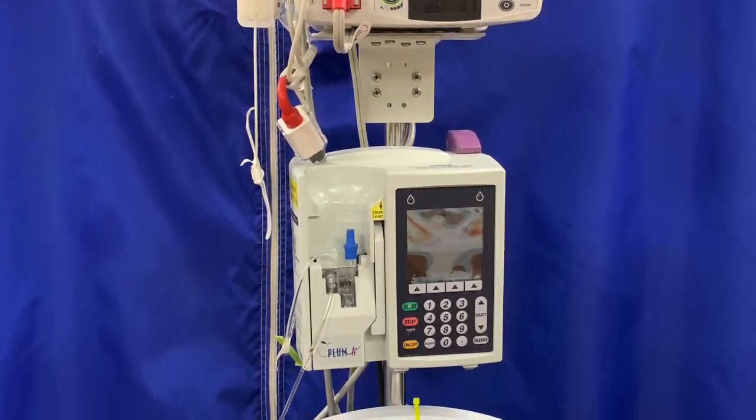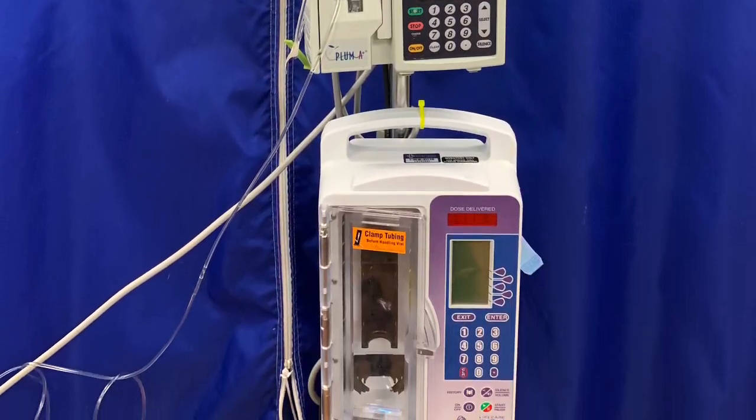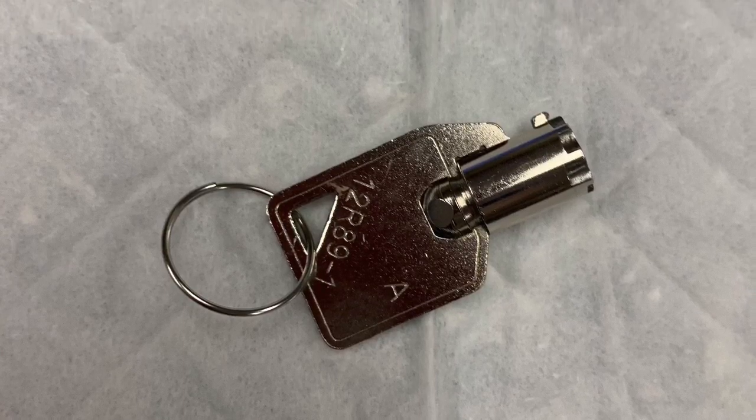Your pump should have a Pulse Ox, a Plum A pump, as well as your PCA pump. Finally, you're going to need to get your key from your nearest Pyxis — that's a PCA pump key. It'll open the door.